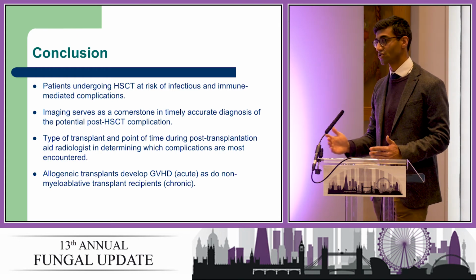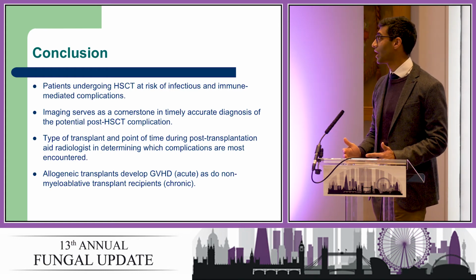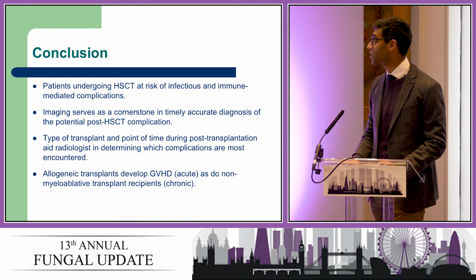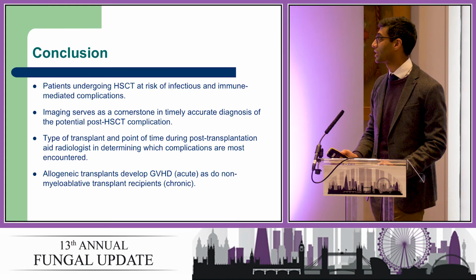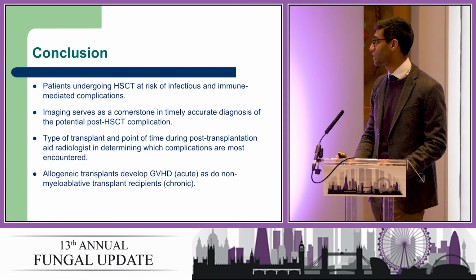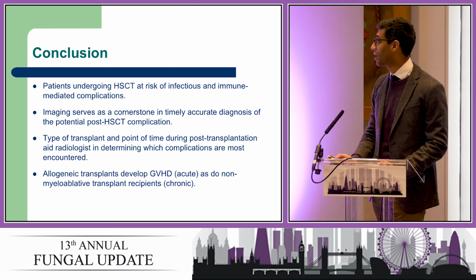The type of transplant and where the patient is post-transplant is imperative in knowing when interpreting the images. And allogenic transplants develop graft versus host disease, as do non-myeloablative transplant recipients in the chronic setting.